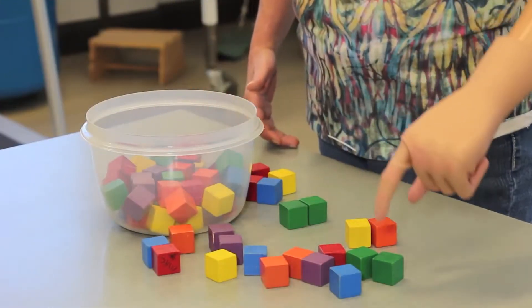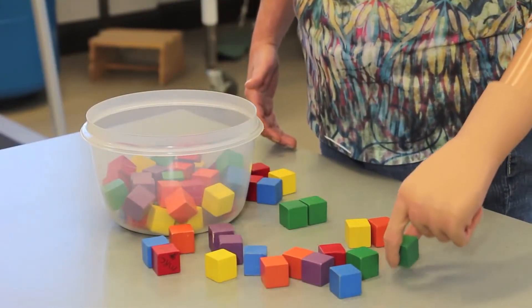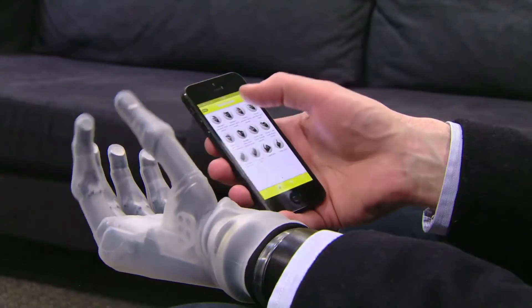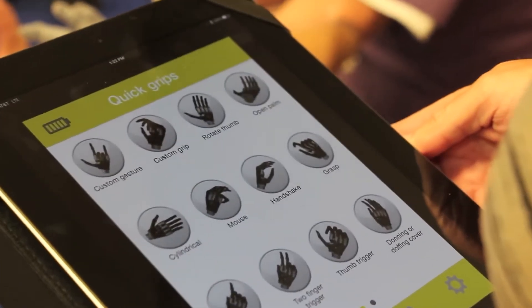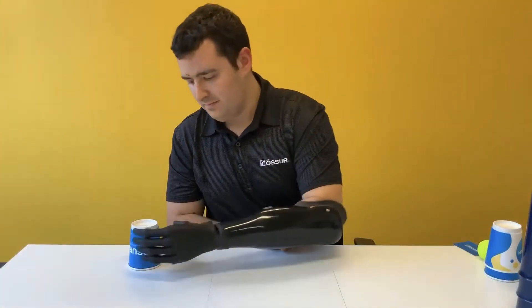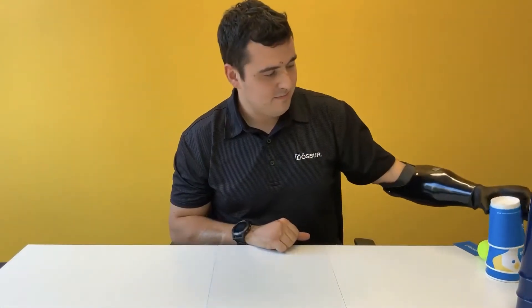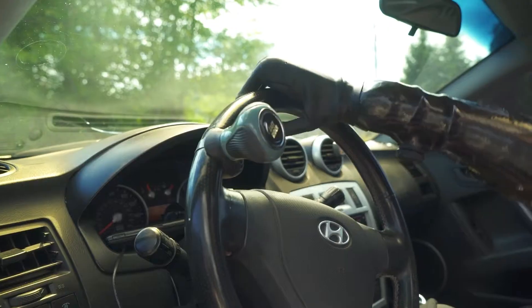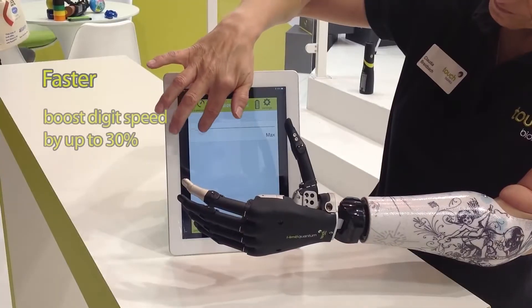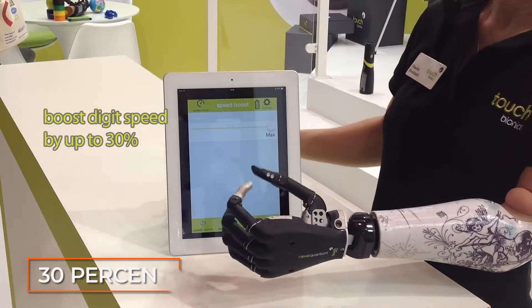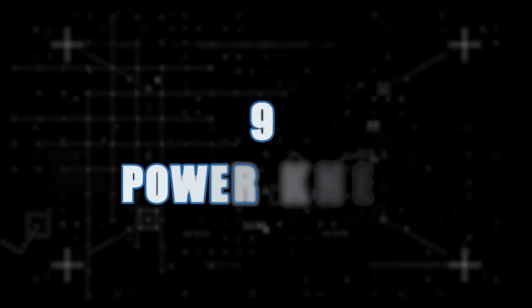For example, two quick muscle twitches will activate a pinch grip. And you can also control gestures and set command shortcuts on the app. It also comes with auto-grasp, an anti-drop safety feature. Since its release, the prosthesis has only gotten more advanced, offering a speed boost feature that can be increased to 30%.